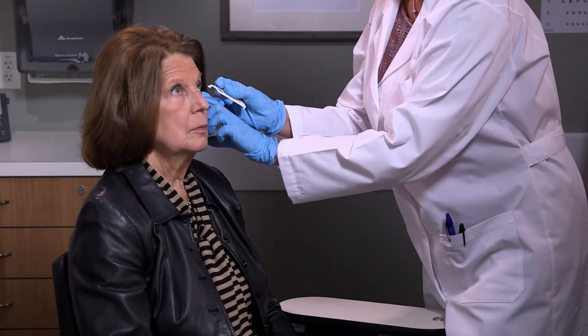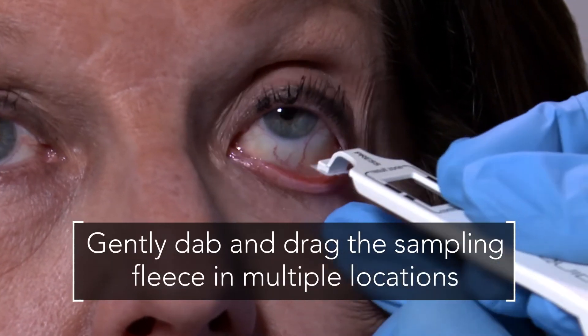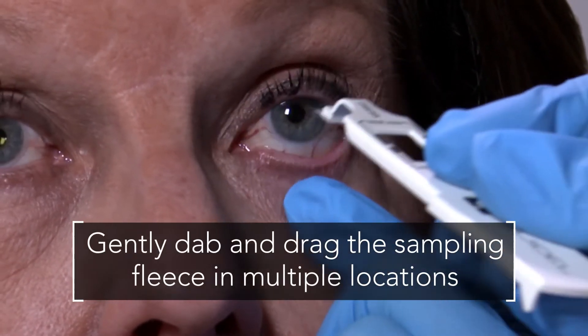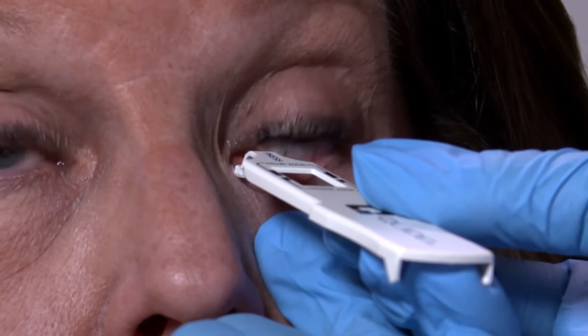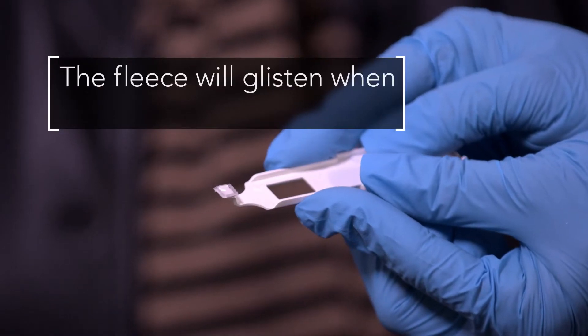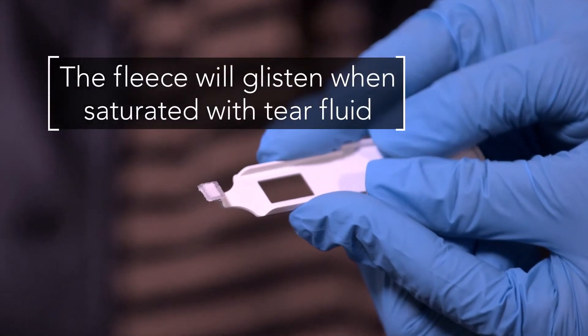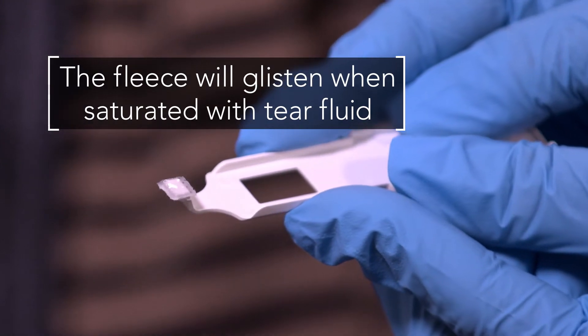Gently dab and drag the sampling fleece in multiple locations along the palpebral conjunctiva six to eight times. Then allow it to rest against the conjunctiva for an additional five seconds. This will moisten the sampling fleece. Upon saturation with tear fluid, the fleece will glisten. Based on tear volume and composition, the fleece may appear white or patchy pink in color.